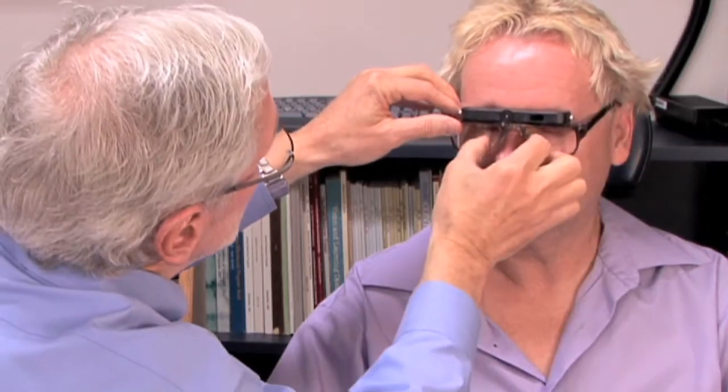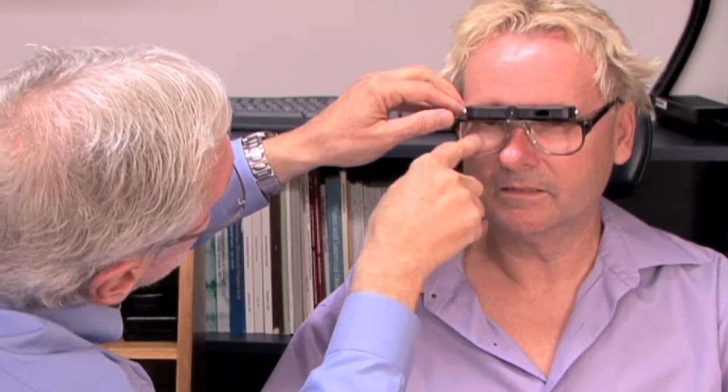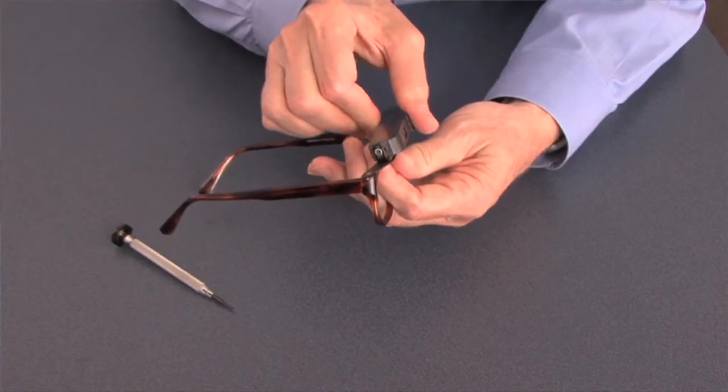There are three steps to fitting the telescope. First, slide the telescope right and left to get the eyepiece lined up properly. Second, adjust the bridge to get the frame as low as you possibly can so that the top of the frame lines up with the top of the pupil. And lastly, change the angle of inclination so that when the patient drops their head down, they're looking directly through the eyepiece.